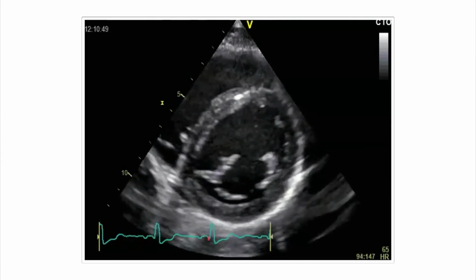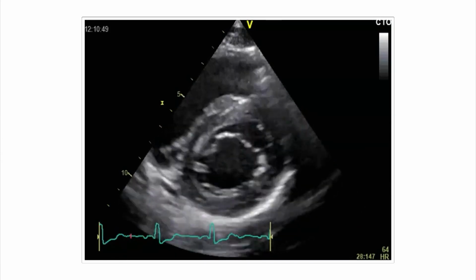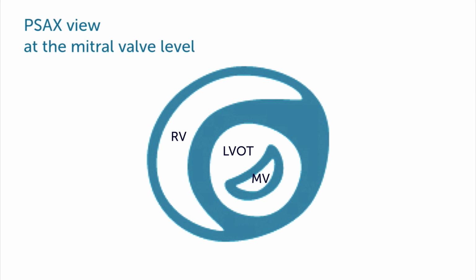These are just some examples of where you can use the short axis view, and now we've got a question for you. At which level of the ventricle are we now cutting the short axis view? Well, at the mitral valve level. So you see, it's not so difficult. So this concludes this chapter on the parasternal window. And next on our list is the apical window, which I think you will agree is probably the most important window in echocardiography.